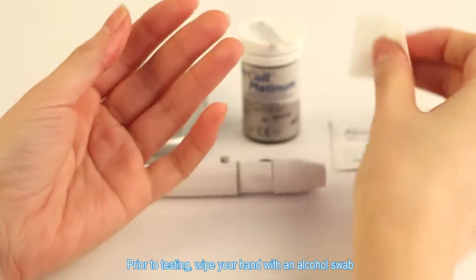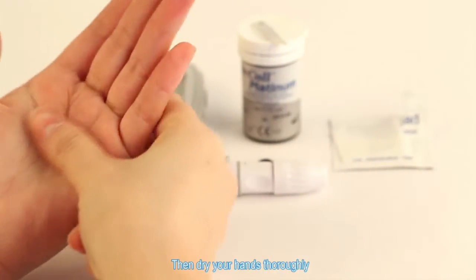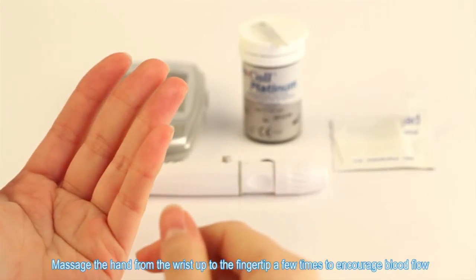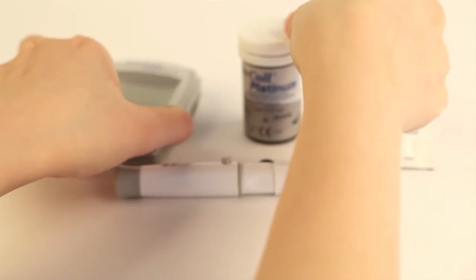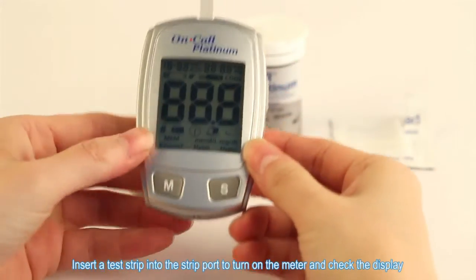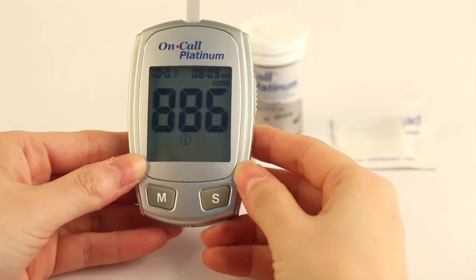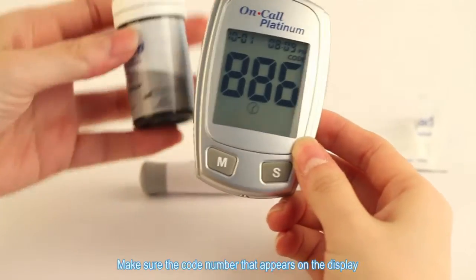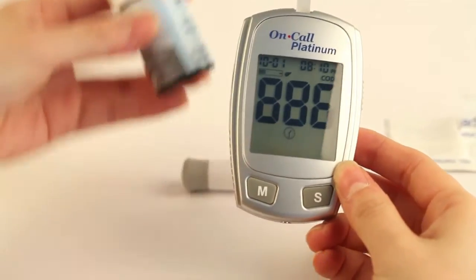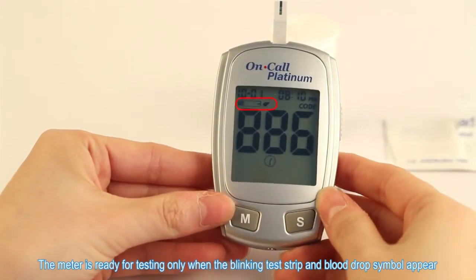Prior to testing, wipe your hand with an alcohol swab or wash your hands with soap, then dry your hands thoroughly. Massage the hand from the wrist up to the fingertip a few times to encourage blood flow. Insert a test strip into the strip port to turn on the meter and check the display. Make sure the code number on the display matches the code number on the test strip vial or on the foil pouch. The meter is ready for testing only when the blinking test strip and blood drop symbol appear.